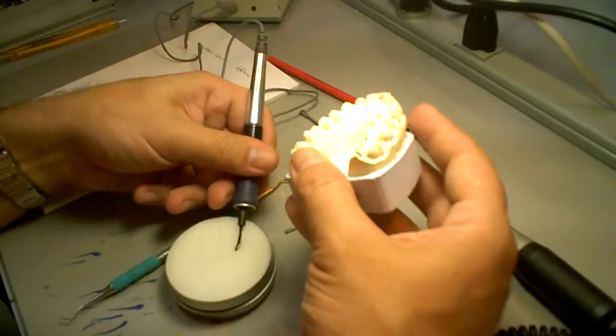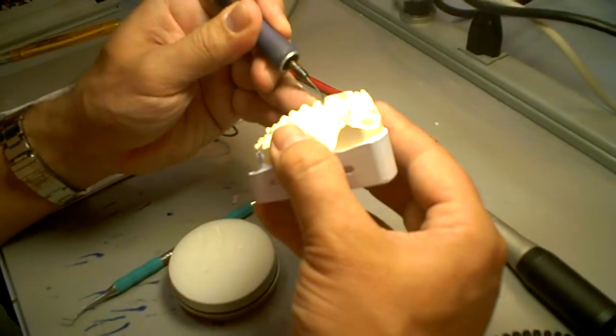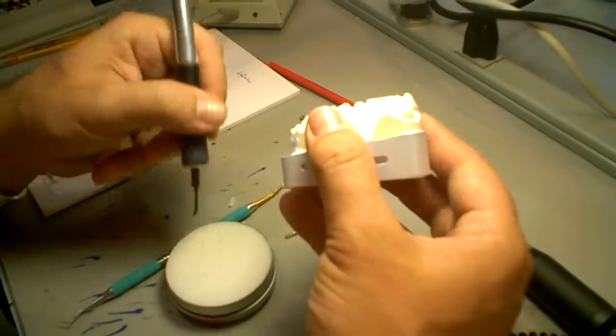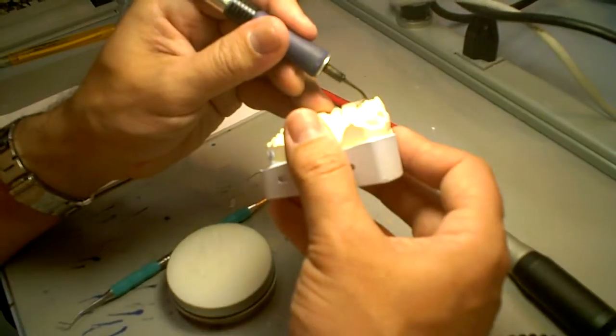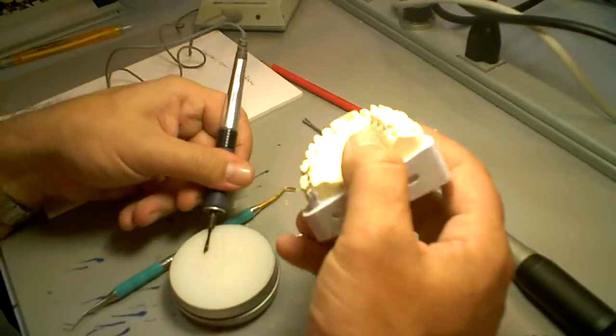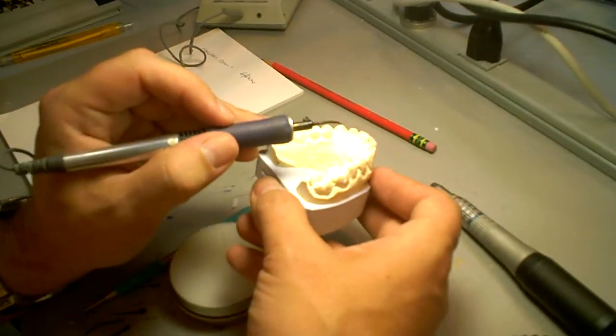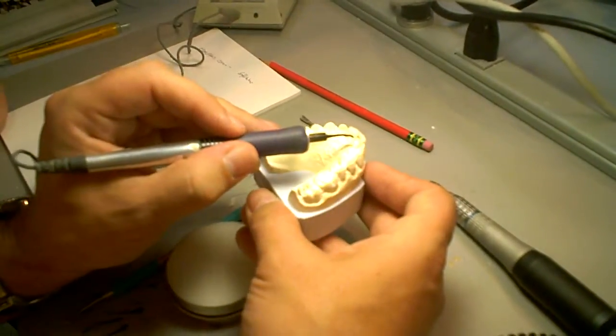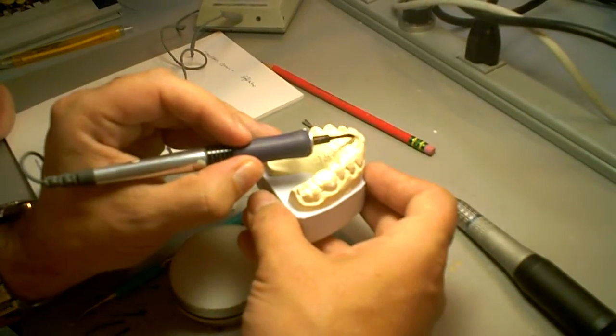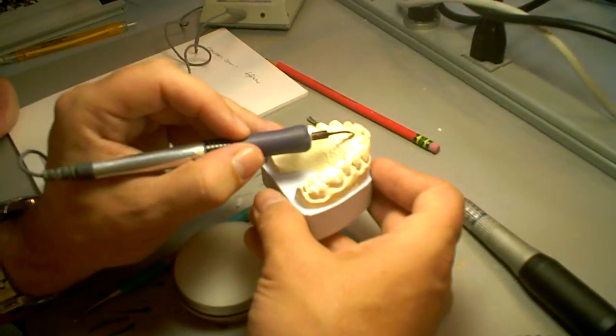So we're going to fill this lingual. And again, this depends on you how much you want to prep on this tooth at this stage. I try to go conservative because we want to introduce composite on top of your rough preps. On something like this, you can definitely keep it a veneer if you want to. But I would suggest you prep a little bit more so then the technician or yourself can add a little bit of material here so then the patient doesn't feel funny.